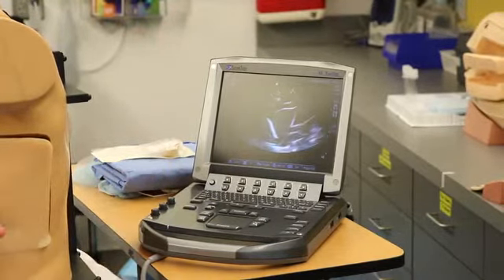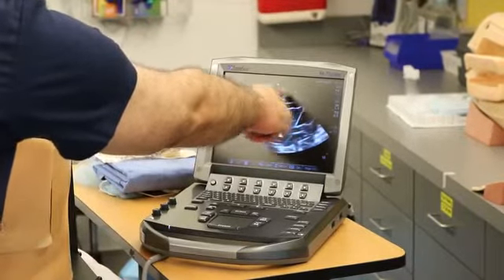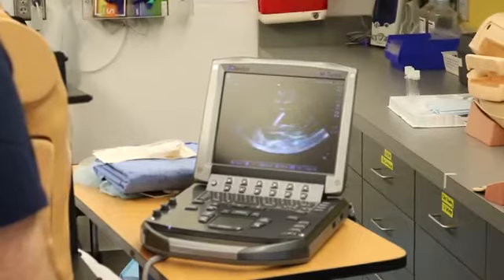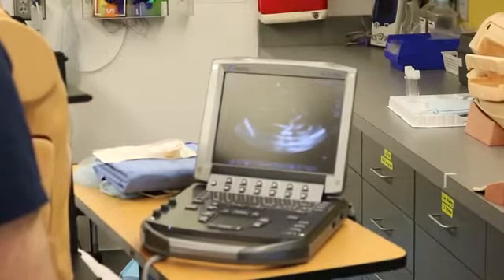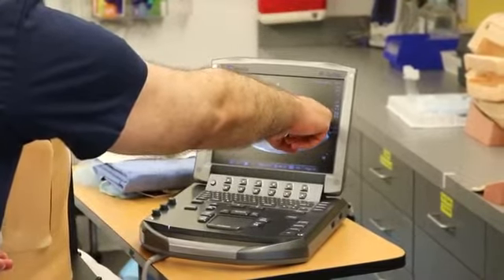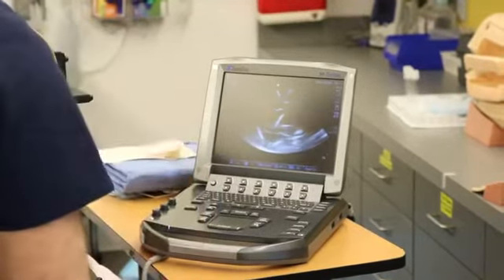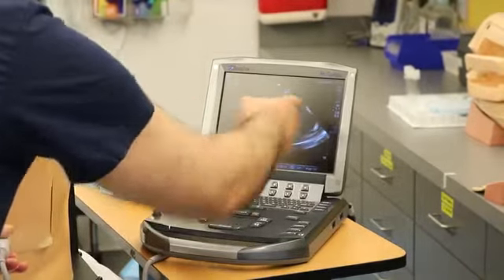If I go up a little bit, you see the lung here, the pleura here, there's a little bit of black fluid there. If I go there, I may hit the lung, so it's not a good spot. So now I'll go down and try to find my diaphragm. And here is my white line diaphragm. So this is my diaphragm, and below it will be the liver on the right, the spleen on the left. This is my lung, and this is my rib, and this is probably a good space to go, to go here with my needle below the lung and above the diaphragm.